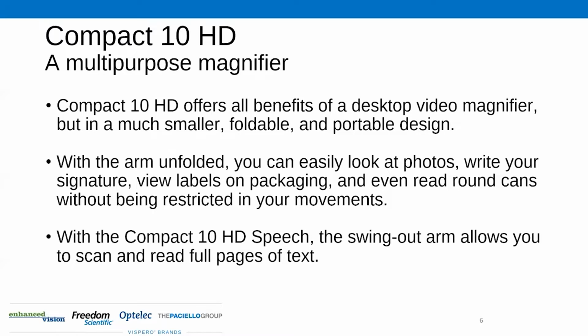And the flexibility of this device. As I said earlier, we often think about what's the silver bullet that can do everything for everybody, and that typically doesn't exist. But having a device that's both portable and provides the type of power that you would normally see in a desktop environment is a massive hurdle for me that we've managed to solve with this device.